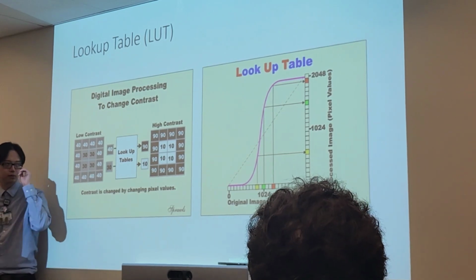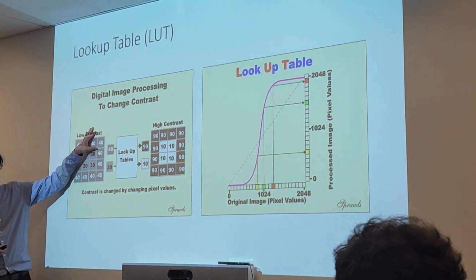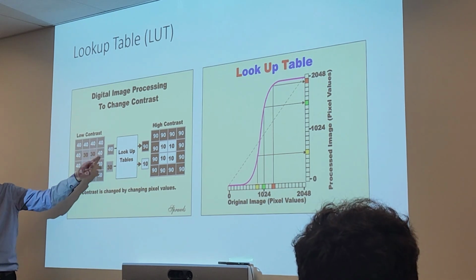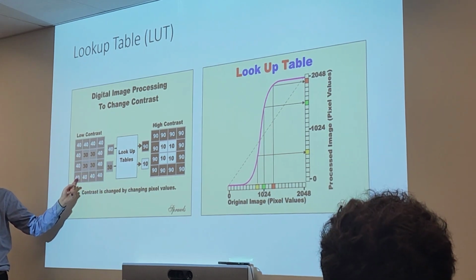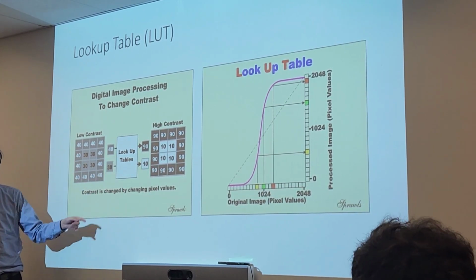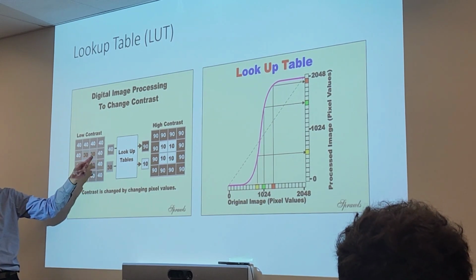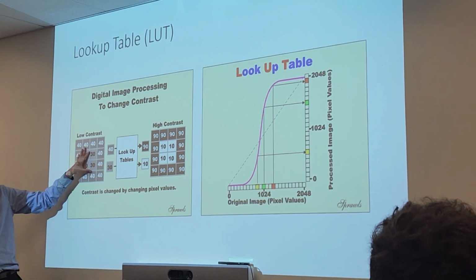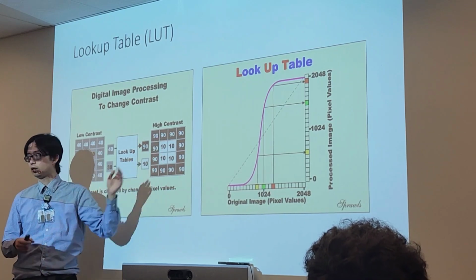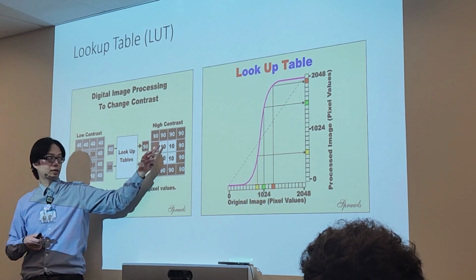Right. So, another diagram of how the lookup table works. You start off with this image here. This is our raw data. You see that the colors have numbers. That's quantization. You take those numbers and run them through the lookup table. The lookup table says, all right, anytime I see a 40 here, I'm going to switch that to a 90. Anytime I see a 30 here, I'm going to switch that to a 10. And so at the end, those numbers get converted, and you can see that we are using a much wider range of colors now. Instead of just dark gray and light gray, we actually have black and white now.